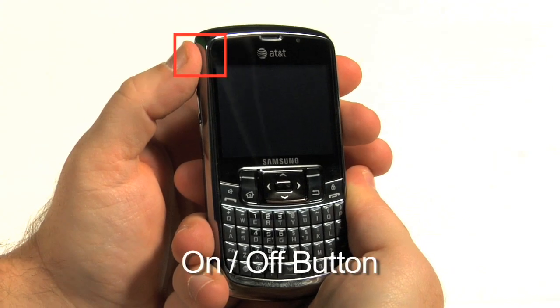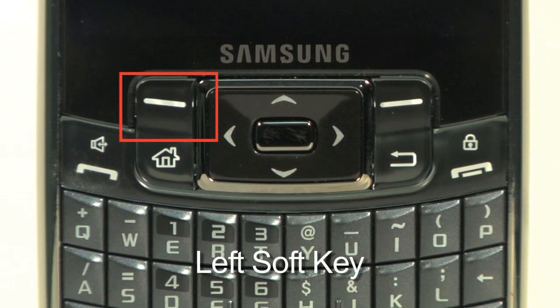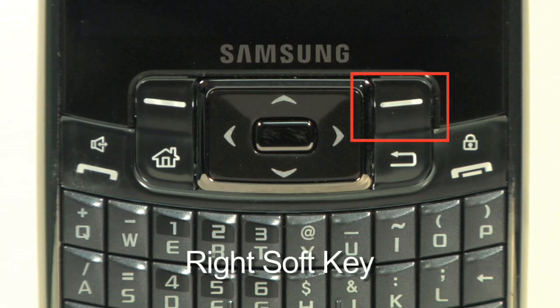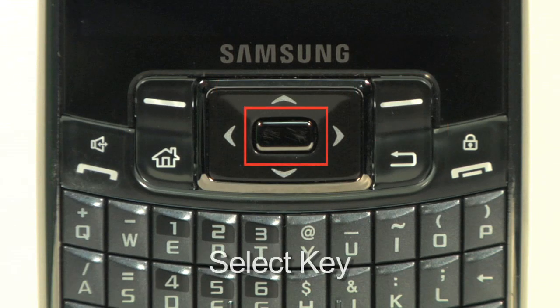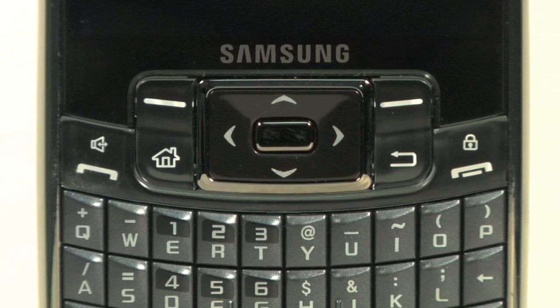Let's first become familiar with the smartphone. There are a few buttons you will use throughout your 30-day procedure: on-off button, left soft key, right soft key, select key, directional arrows, and back key.